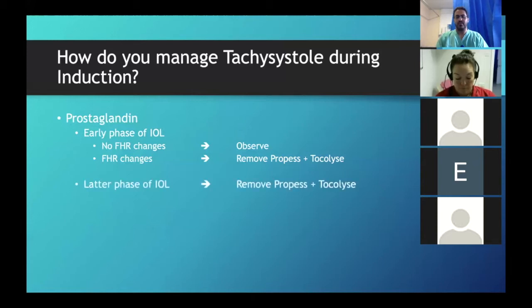Can I just ask with that, when you say fetal heart rate changes, do you mean like the baseline, or are we just including any kind of shallow decels? You've seen that the baby, she's contracting now 6 in 10. Baby is properly decelerating with those, okay? This baby is not gonna make it for long, even if the baseline is maintained at the moment. You really need to try and figure out whether this baby is gonna cope.